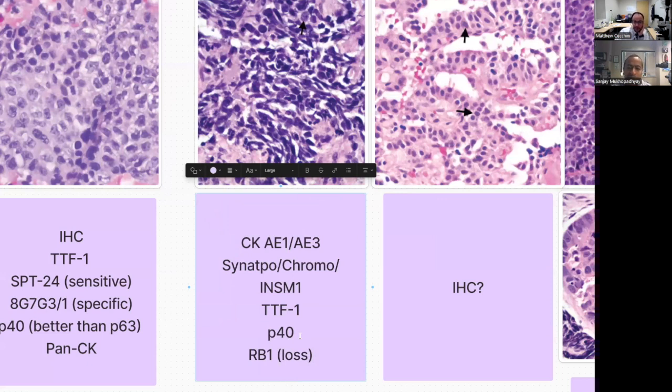What about you? Same. I put Ki67 on it as well. Especially in these scenarios where it's crushed, and I just always worry that I'm looking at a crushed carcinoid, especially in a small biopsy. And so to me, that's just kind of a safety thing. Also, depending on where you practice, some clinicians really want the Ki67 index, even though in the lung it doesn't have the same role as in other neuroendocrine tumors.